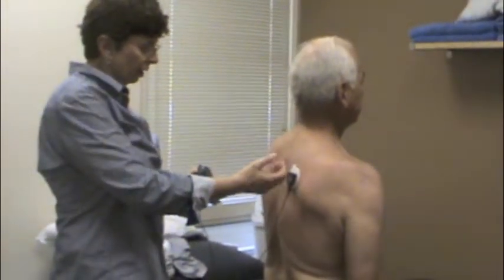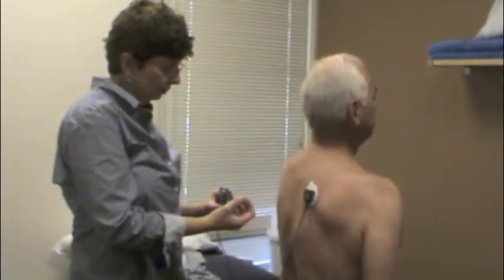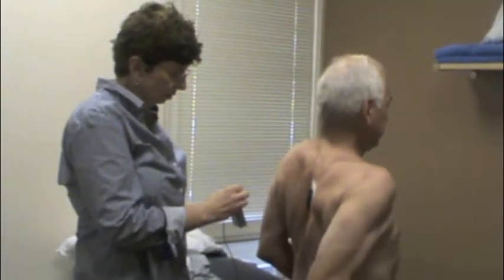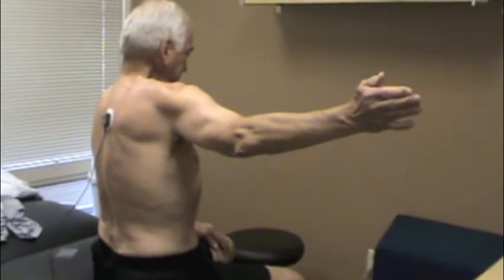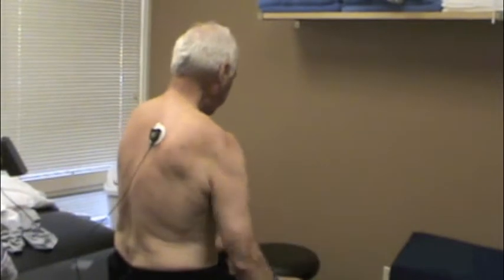Dan, go ahead. The biofeedback just tells Dan when he's getting a good contraction — keep doing that, Dan. Getting a good contraction of those muscles. Perfect, good. And then the next one I want you to do is keep your arm and then just go out. Good, and then go to the front.